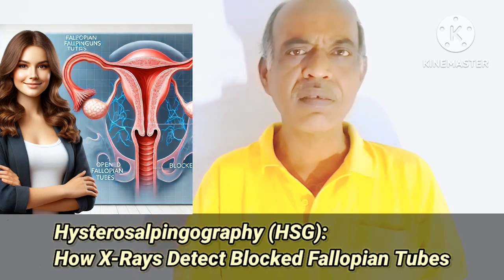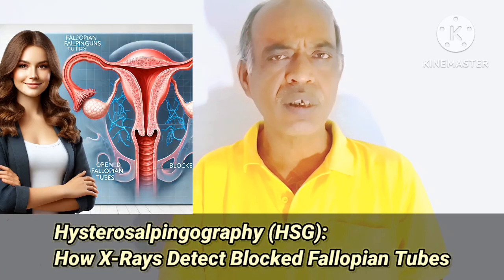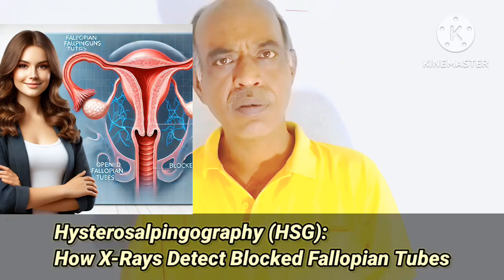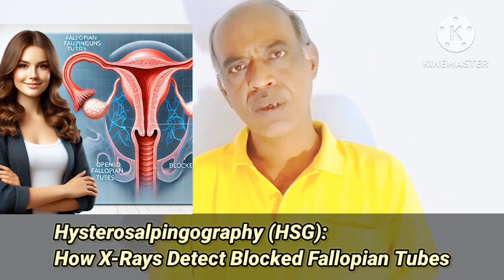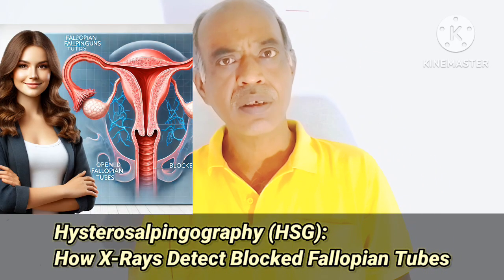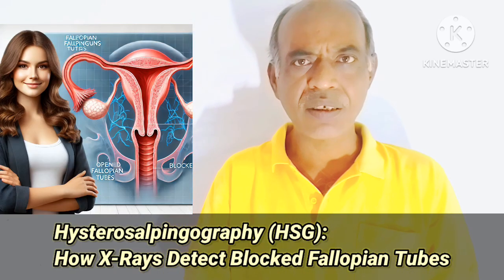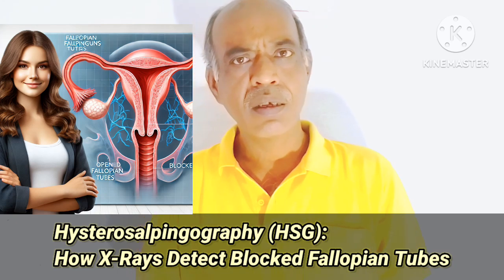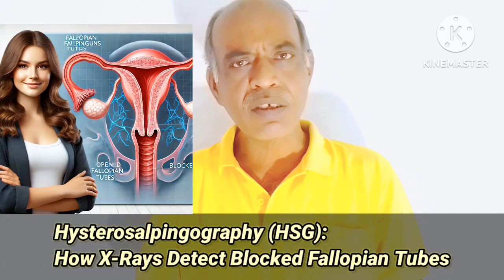So in some cases antispasmodic medications are given to the patient for the relaxation of the spasms. Again, in a few cases, if they find any blockages, doctors wait for some time and take a second image, so that the spasms get reduced.